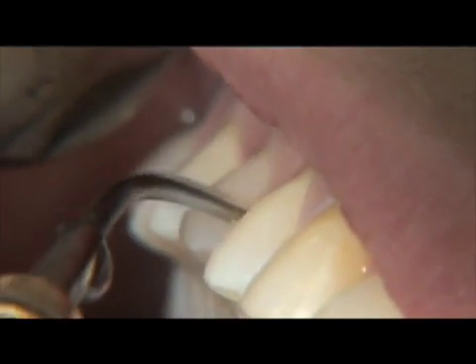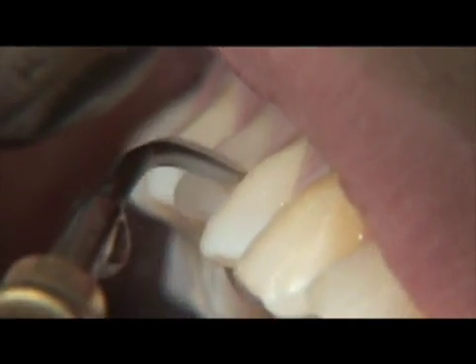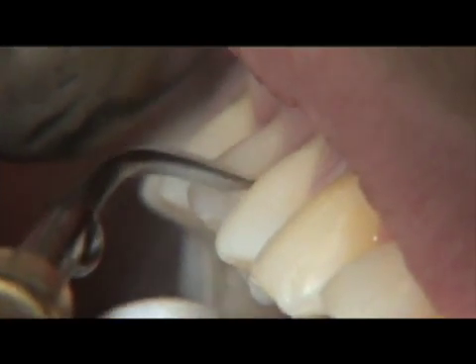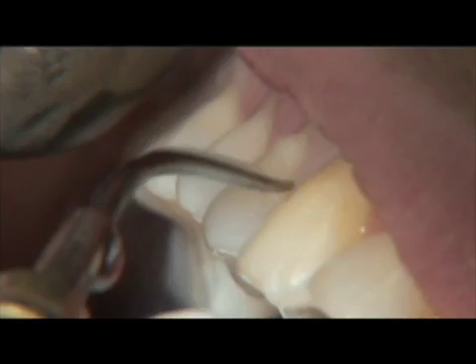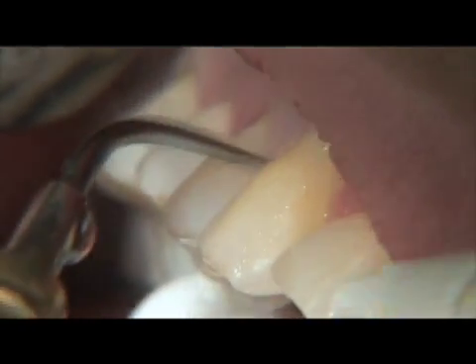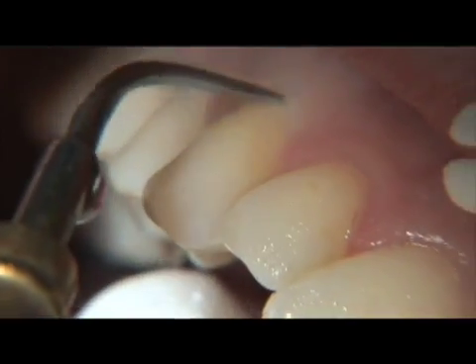The next phase of treatment employs the use of ultrasonics and conventional hand instruments. The reason we begin laser periodontal therapy with sulcular debridement is that it results in a significant reduction of bacterial levels.